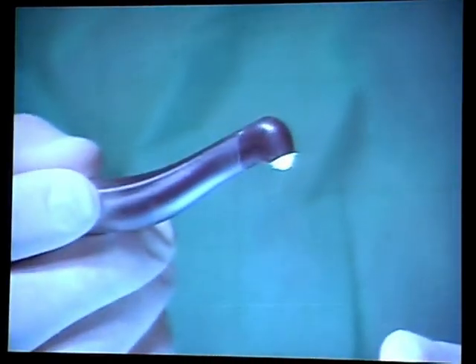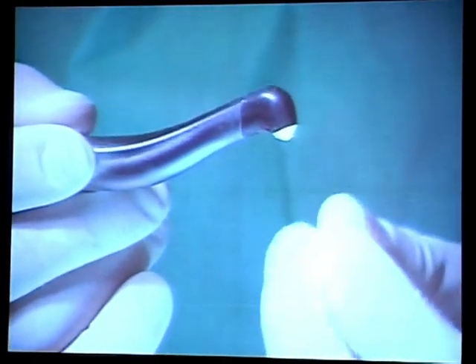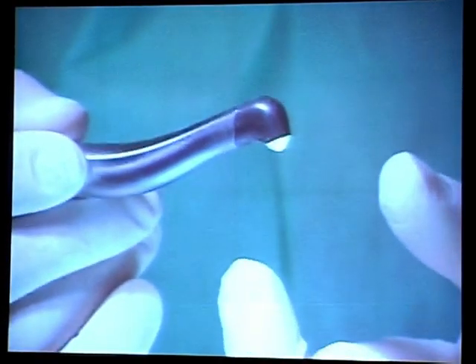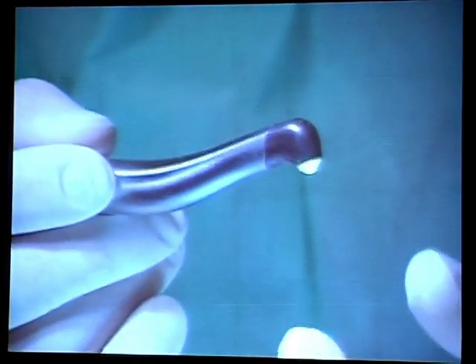And don't use it perpendicular on the surface, because then all the particles will go back and destroy the fiber. So it always has to be used angled on the surface. Okay, now we'll switch it on. You will see the water spray coming out of here. The water spray absorbs the laser light and the water is heated so fast that it explodes. And you can see and you can hear all the pulses from the exploding water.